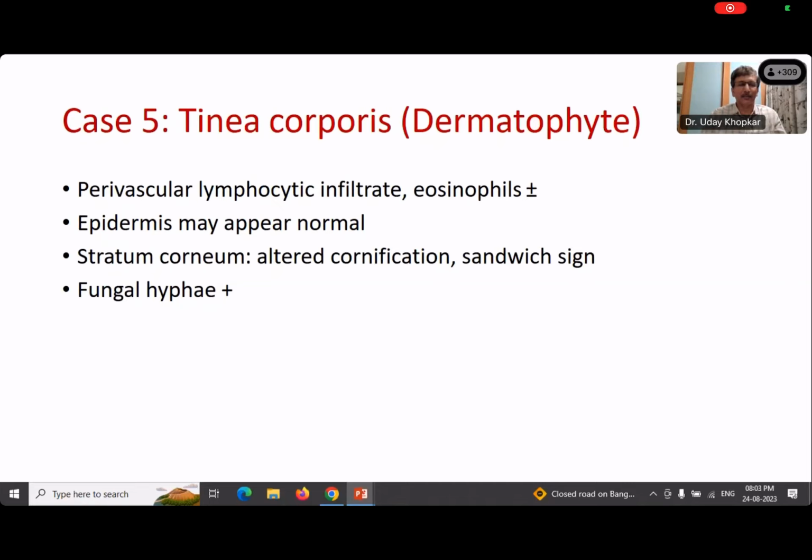The skin lesions in dermatophytosis can vary once the patient starts using combination creams containing steroids, and then the diagnosis of fungal infection becomes difficult to make out. That's why we call it tinea incognito. And this could be one such patient where inflammation was minimal and the hyphae are numerous. So that may be one of the reasons this patient may be using steroid-containing creams.